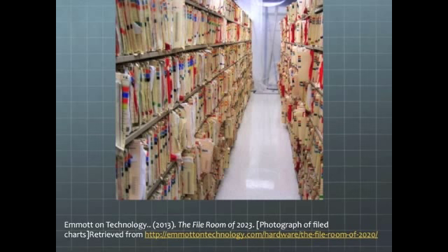I think, maybe where I was working, we started to get one room that was CR, but we still were using film. So what we'd do, those CR images, they would come up on a computer screen, but we'd still print them to a daylight processor. Now we're in DR, which is digital radiography.